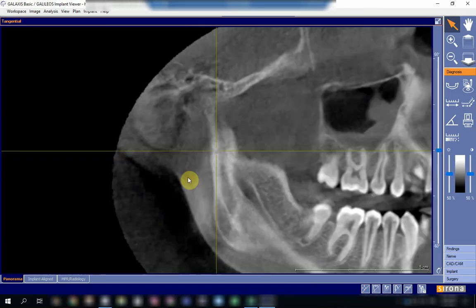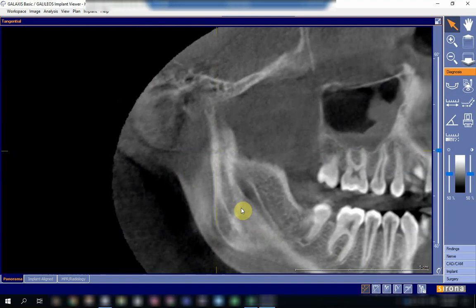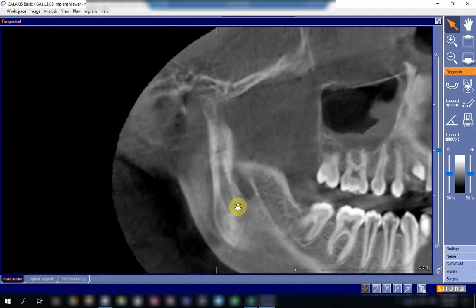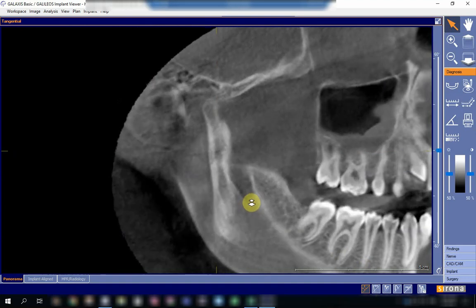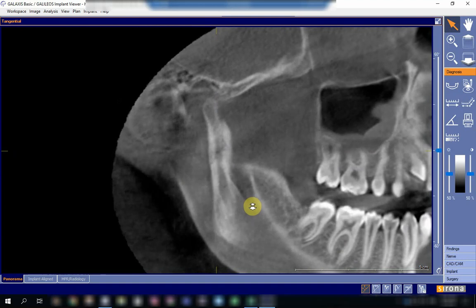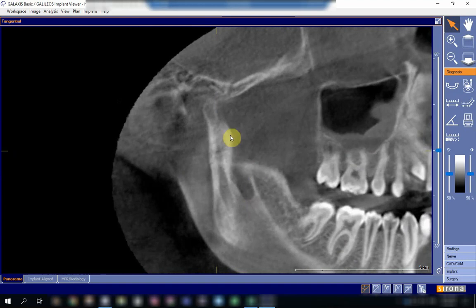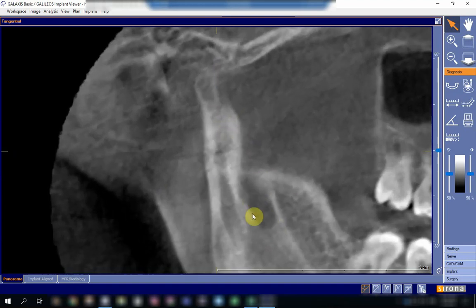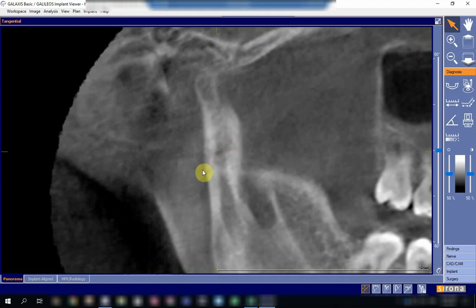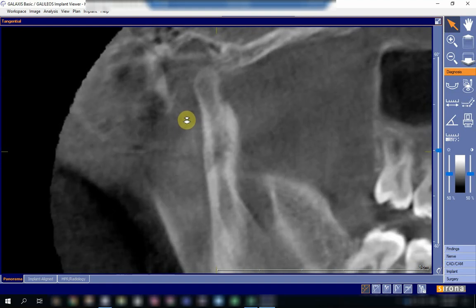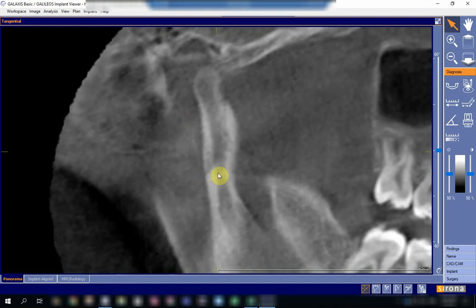Let's have a look from the sagittal view. In the sagittal view, I can see that the fracture site is here. The fracture is actually extending from here upwards — from this side upward. This is the fracture over here.